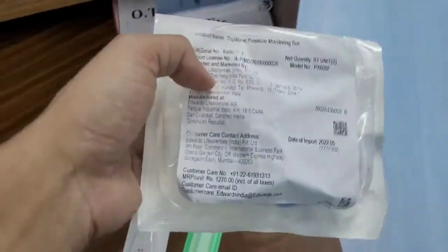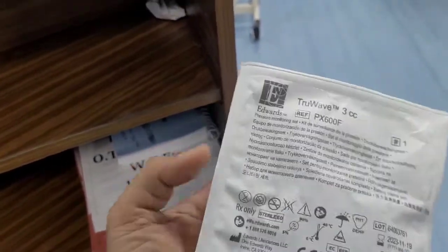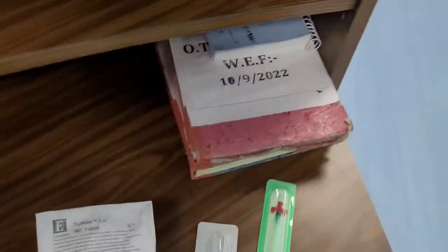This is the transducer dome, the most important part of arterial monitoring. It is connected with the monitor and gives you arterial monitoring. Now I am going to show you how to monitor invasive blood pressure with the monitor.